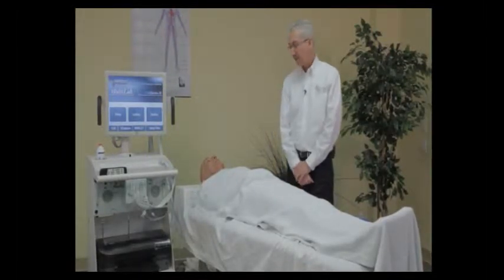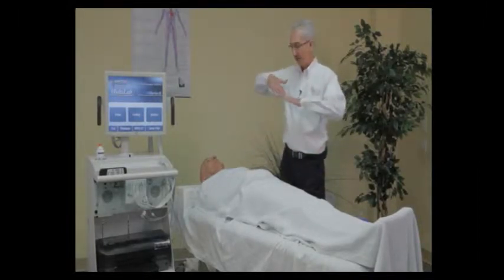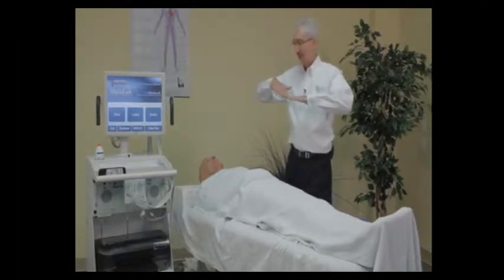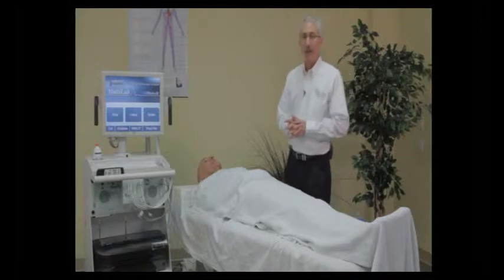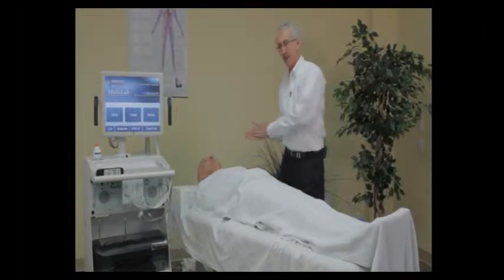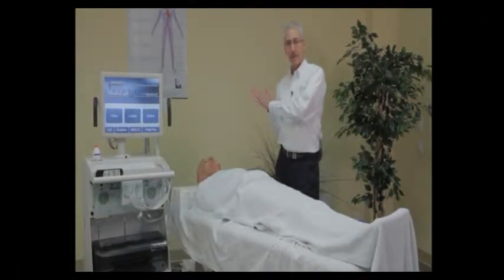Right now, my patient is completely supine on the table. A lot of labs have the backrest angled at 45 degrees — that is going to skew your results negatively. The patient must be supine with a support for the head about 6 inches tall. If the patient has back problems or breathing issues, elevate the head of the bed as little as possible to ensure patient comfort.